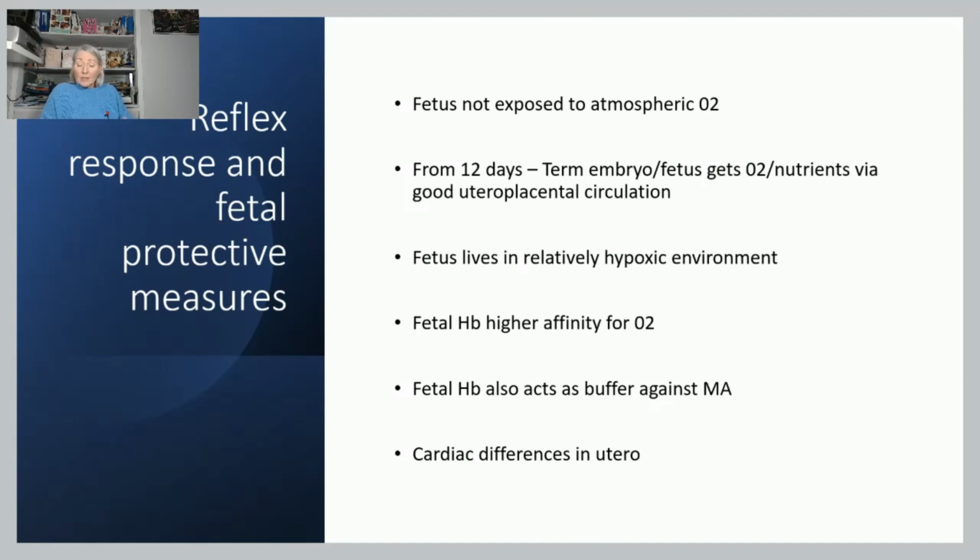So the only thing they can do is actually drop their heart rate in order to reduce the myocardial workload and to maintain its positive energy balance. So this is a reflex response to protect the myocardium against both hypoxic and mechanical stress. And so we're hearing that as a deceleration.